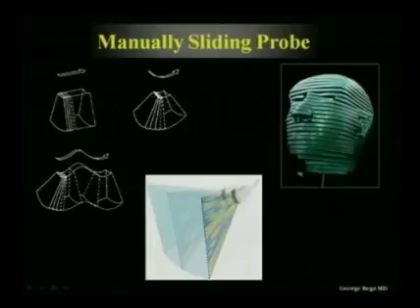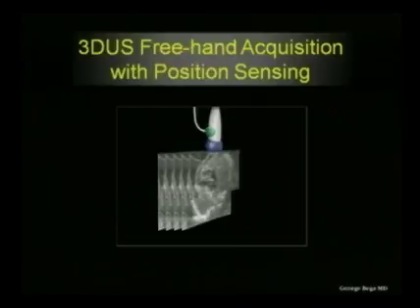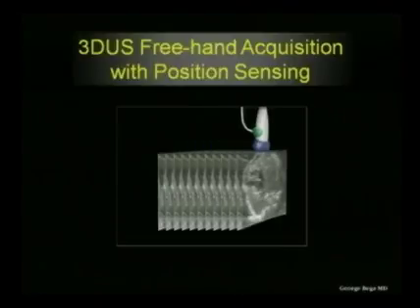The end result is pretty much this. We would ideally expect any acquisition method to give us a nice registration of these 2D slices. But this process is really not easy and not as straightforward, especially if it has to be done with a freehand acquisition. And that is the main reason that the industry has been coming up with new acquisition methods.